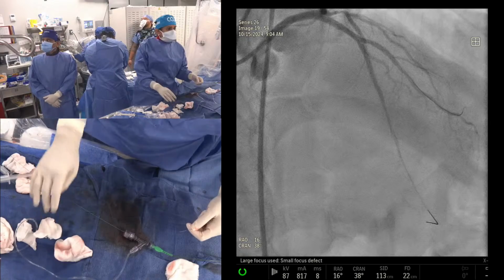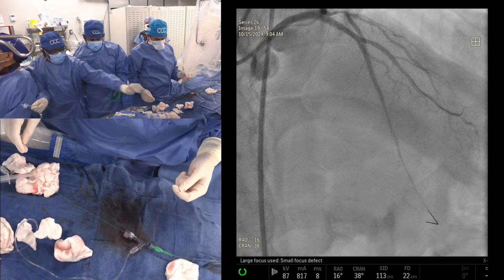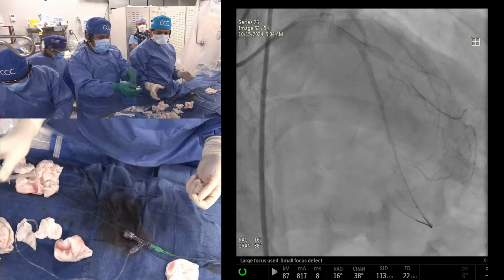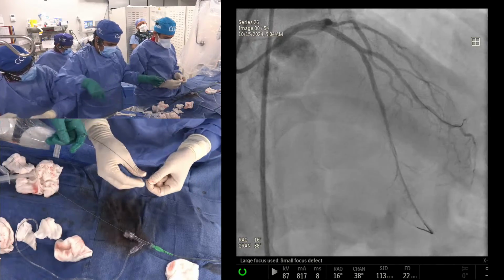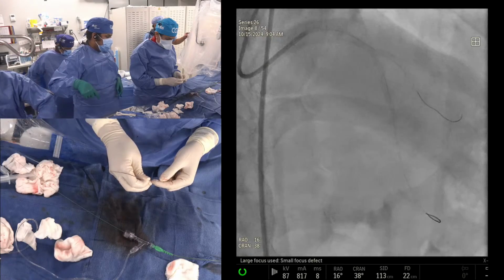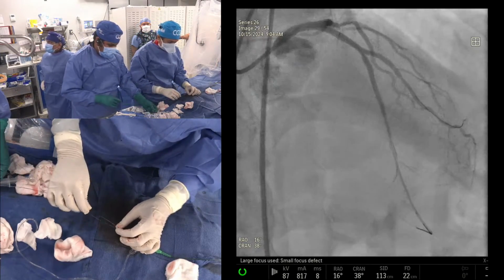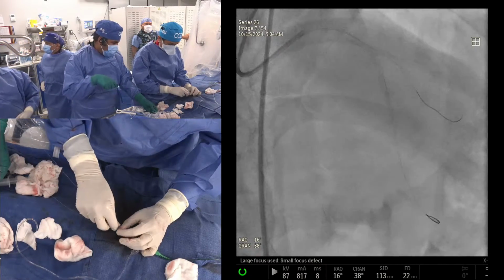I mean, a very strange observation. You have a 25-30, right? Something you see commonly. You think there is a little myocardial bridge in the mid portion of the diagonal? Yes, we do see that. Several suggestions, mainly talking about that, outside the US, this is a straightforward bypass case. Or drug coated. Yeah, the drug-coated balloon, drug-eluted. Which I think is distal LAD? Completely right. Yeah, distal LAD. And a few other suggestions that this is more of a nano crush than a mini crush, but all those are good observations.